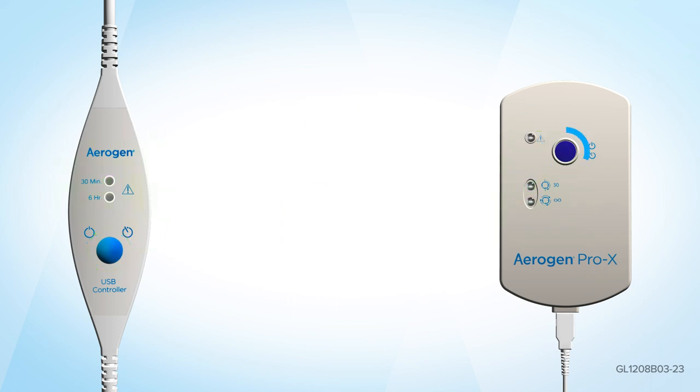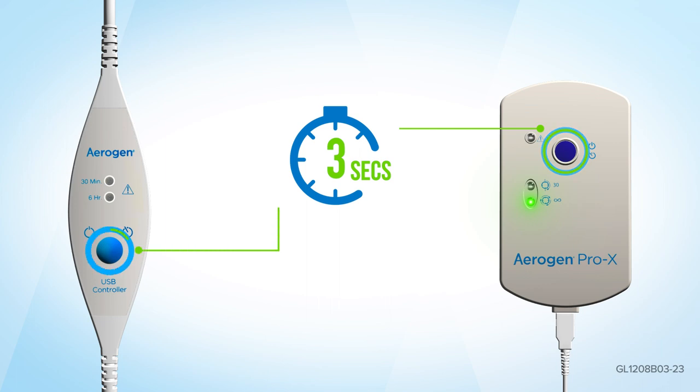When using the Aerogen Continuous Nebulizer tube set, press and hold the on/off button for 3 seconds from the off position to operate the Aerogen Pro-X controller in continuous mode, or the Aerogen USB controller in 6-hour mode.